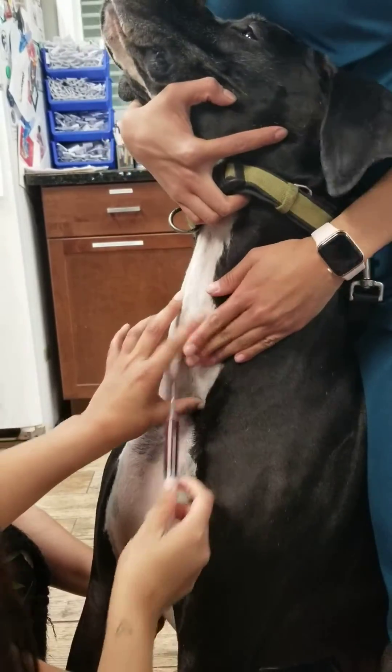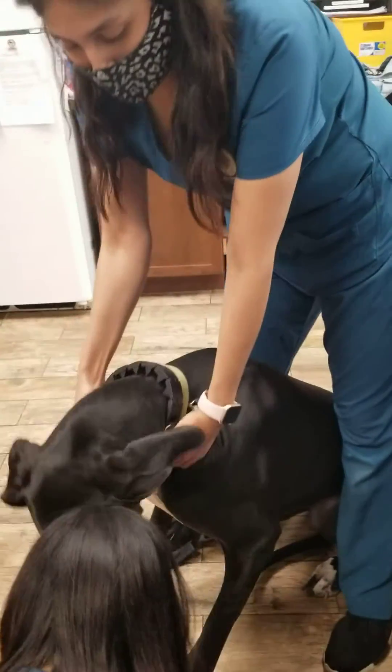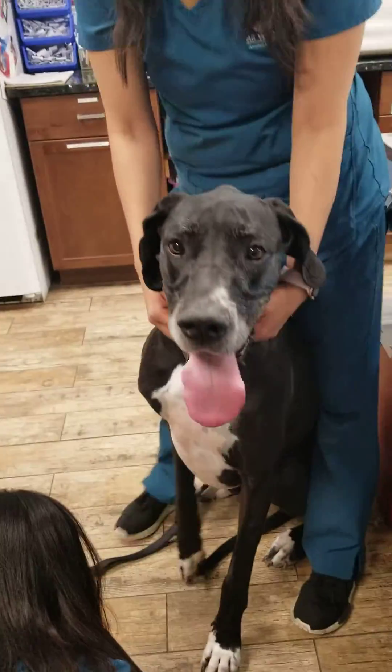All righty, perfect. And so we will just hold off on the area for about a minute, and that is how we do our blood draws.